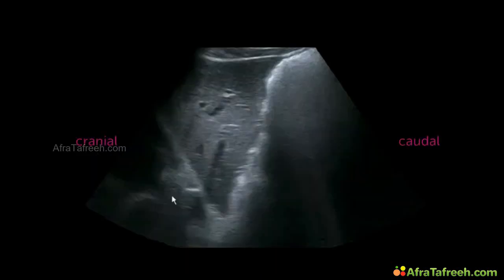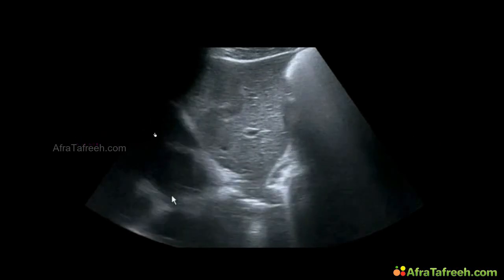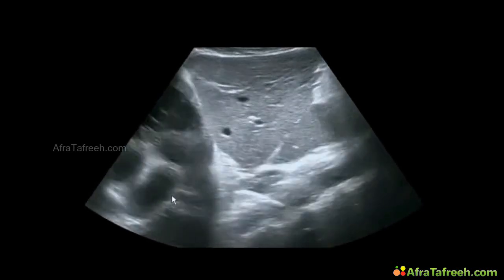Now we will show you a video clip of this view of a longitudinal epigastric view. The left liver lobe. It's lovely. You can see the heart beating over here. Yes. Gas in the stomach, and in between left liver lobe. It's getting smaller and smaller. That means the transducer tilts more to the left side and back again until the median line. So that's longitudinal epigastric view.